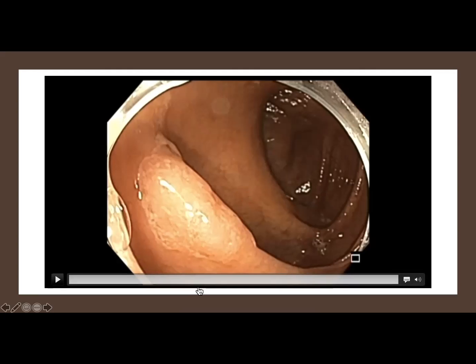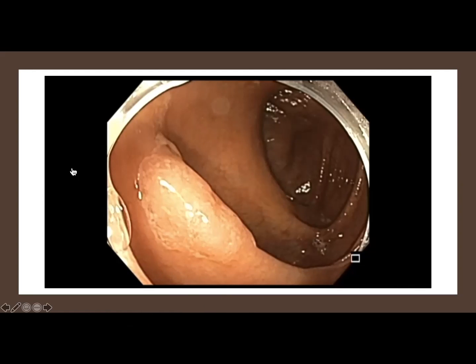Having made those comments, I want to hear from our group what they think. Roy, Sylvia, Selvi, why don't you comment on what I've said? It's very dangerous to ask me about cold snaring, because I believe that anything in life that's done thoughtlessly is not going to produce anything good. Doing this thoughtlessly using cold snare will not be a good idea. It's big, you need to orient it, and it shouldn't be cut up like corned beef.